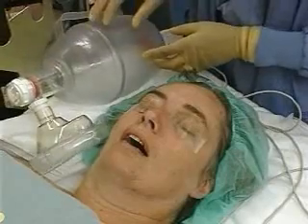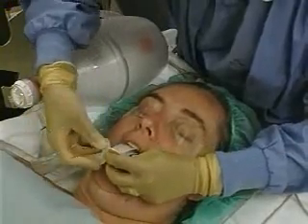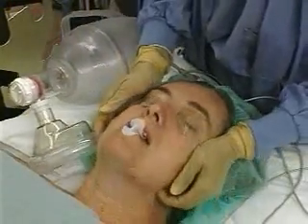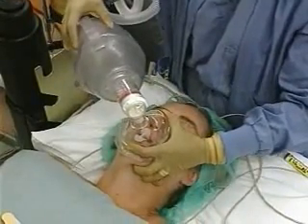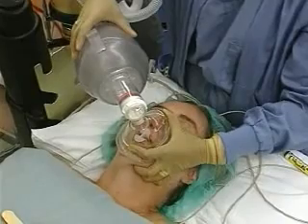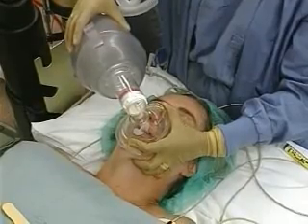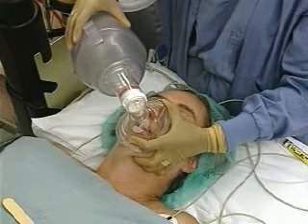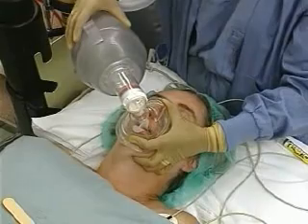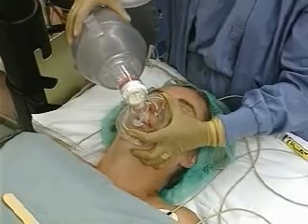Positioning should be supine. Place an oral or nasal airway. Hold the mask in the left hand with the thumb and index finger gripping the mask around the rim, with the body of the mask fitting into the left palm. Place the narrow end of the mask over the nose, avoiding pressure on the eyes. Lower the body of the mask to the face so the chin section rests on the alveolar ridge, and seal the contact areas by pulling the mandible up into the mask with the curled fingers of the left hand.